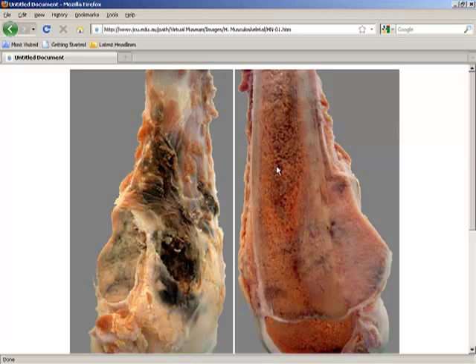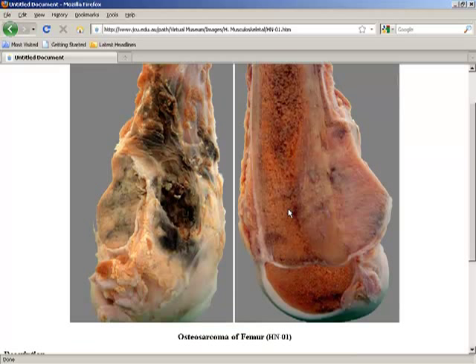Actually, it will be trabecular bone with marrow tissue in between. And observe the tumor here exactly at the end of the metaphysis, and see the intact epiphyseal cartilage. That is the difference between epiphysis and the metaphysis. That differentiation is still maintained, and that's very characteristic of osteosarcoma.